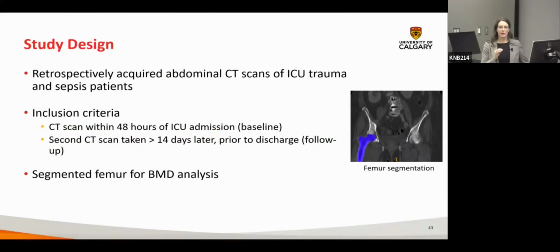And this is specifically looking at the bone, so ignoring muscle for now. So for this, we actually segmented out the femur and then again, applying our internal calibration method, picking out those ROIs and then calibrating the scans from there to get a BMD measure.